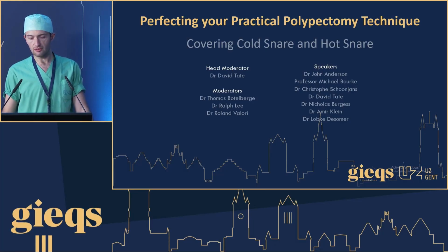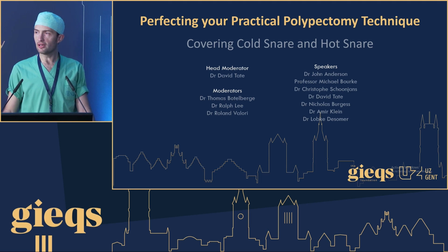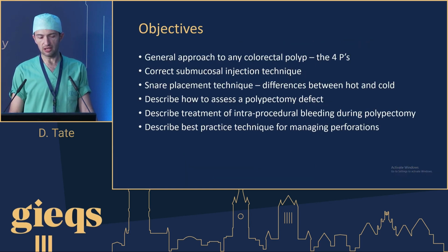Welcome to everybody. We are going to combine a live case in this session, which Michael's going to do, with some cases, and we are going to start to cover different aspects of polypectomy. So let's go to the objectives.